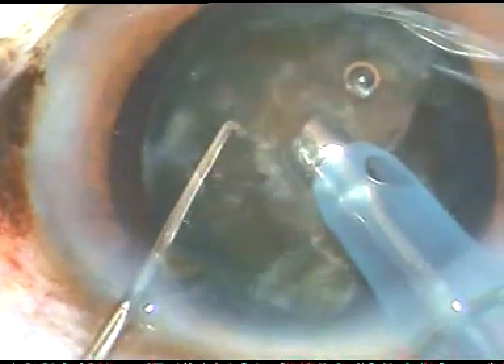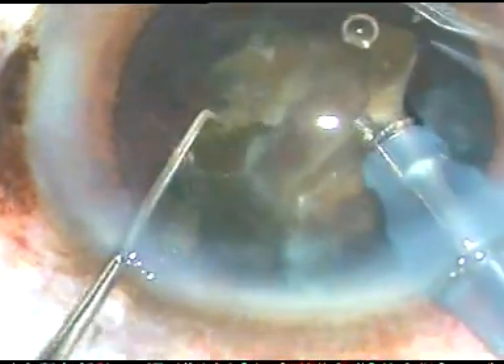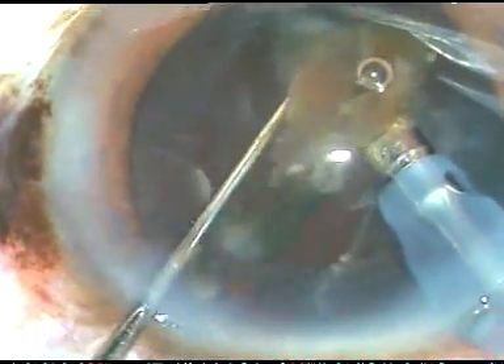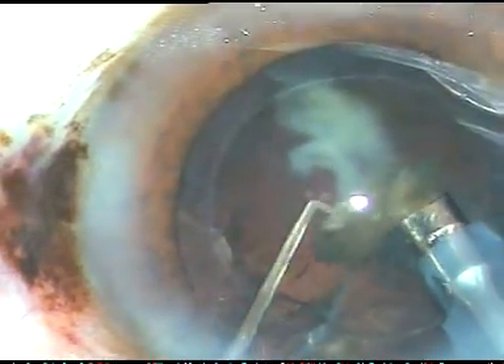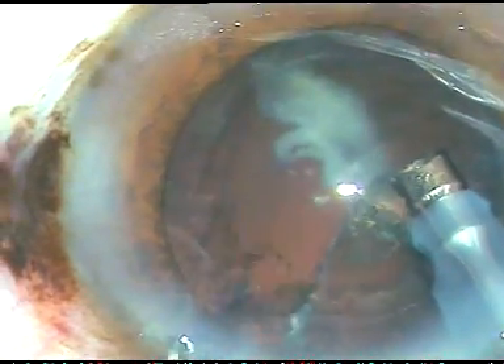Now here I separate the epinucleus and see what happens. The whole epinucleus came first. And here I see that the PC rent has already occurred. So I take this nuclear fragment here and try to emulsify this. Fortunately, the anterior vitreous face is still intact. And the vitreous is not in the anterior chamber.